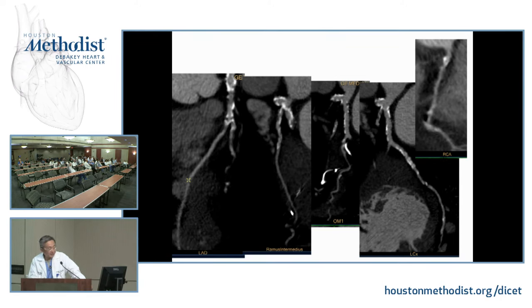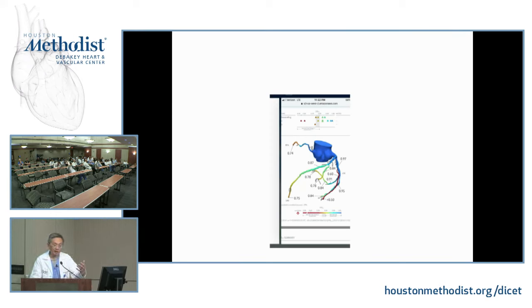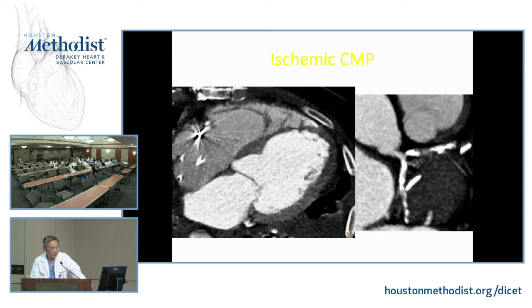We don't know until we do the study, but there's some software that supposedly can subtract the calcium, though it's not terribly well validated. But this is not unusual. We encounter this, especially when we read the TAVR studies. This is almost like the TAVR patients that we read. Obviously for a clinical trial, you would not want to include a patient like this if you want to study the diagnostic accuracy per vessel. But for clinical management, I believe personally, depending on the clinical picture, degree of stenosis, and degree of calcification, calcification is probably not a contraindication to performing a study.